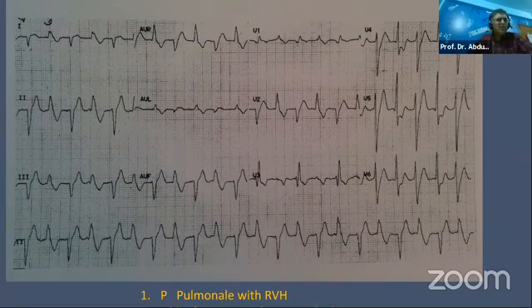And now the question is the sinus rhythm. If it is RV hypertrophy, it's all right, but is there infarction? Because there are QS complexes in leads 2, 3, aVF, perhaps. That means, does this patient have three types of problem? There is a right axis deviation, which may be due to right ventricular hypertrophy or left posterior hemiblock, or there is also inferior MI. Third, there is arrhythmia. Now consider that there is an MI, I will go for a block, posterior hemiblock, because with ischemia, the conduction defect is more likely, and arrhythmia is also associated with ischemia. That's my opinion. I may be wrong.